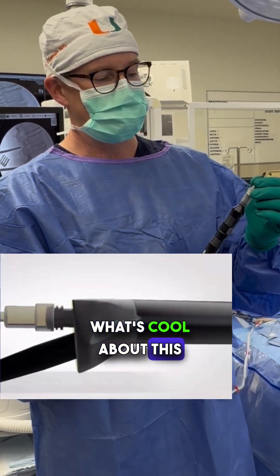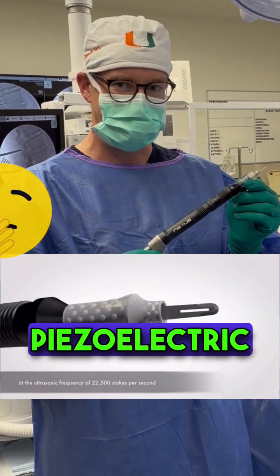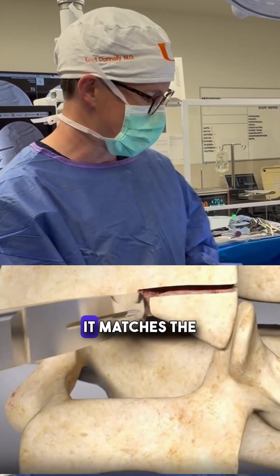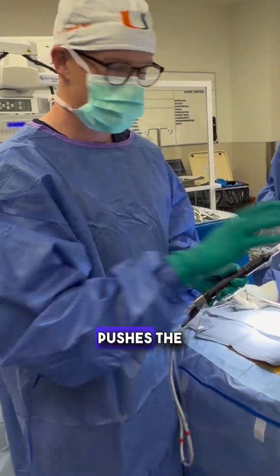What's cool about this — not to get too sciency — is that it pretty much uses a piezoelectric crystal to convert electric energy into ultrasonic energy, which helps melt away bone. It matches the modulus of elasticity with bone and pushes the nerves away.